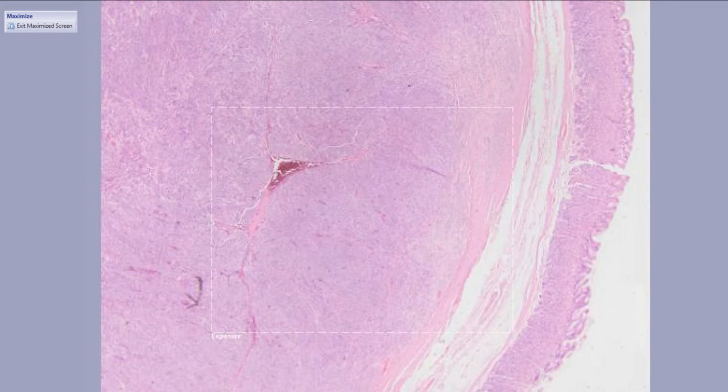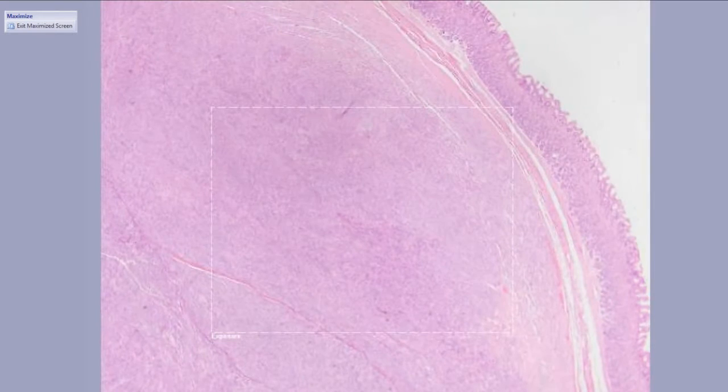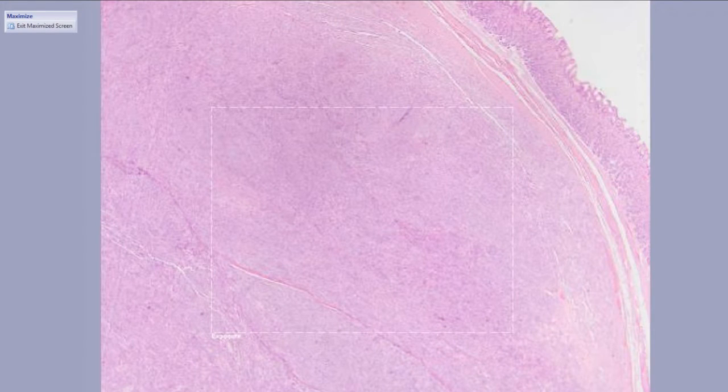When you are doing risk stratification for GISTs, only three things matter: the location, namely stomach in this case, the size, and the mitotic rate. There's a chart that was put together by authors at the AFIP who looked at a whole lot of GISTs. They did an amazing job. So for GISTs in common locations, the stomach, the small bowel, the rectum, you can pull up this chart. It's available in major textbooks and the CAP template, other locations, easy to find, freely available. You can see the likelihood of these tumors recurring.